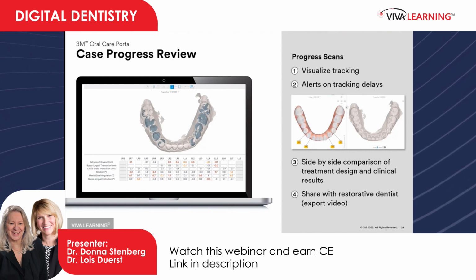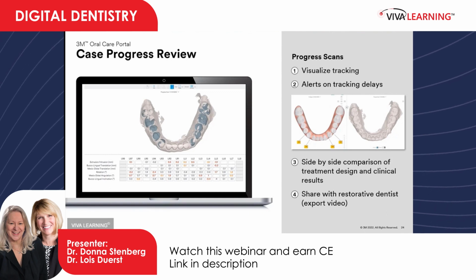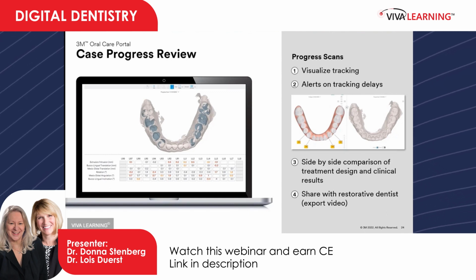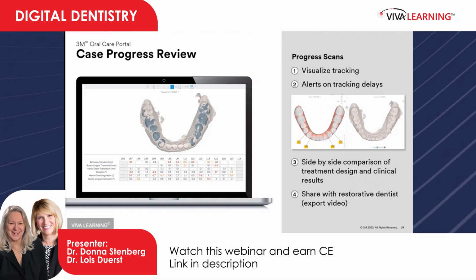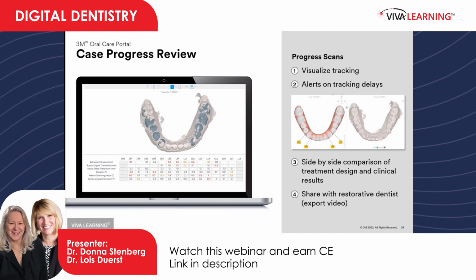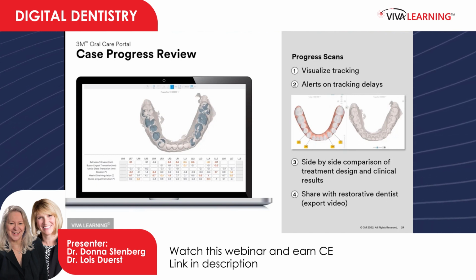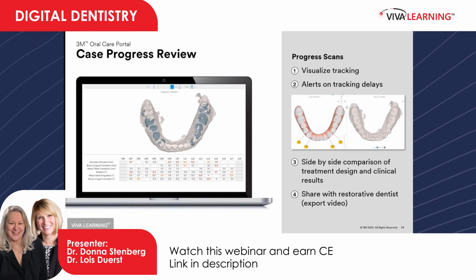You can use the movements table again to quickly draw your eye to what's not tracking with the treatment design. Sometimes a side-to-side view can help you see the changes more clearly. And while I'm right there in the portal, I can export a video to Lois so she can see the progress to date. It reminds her that we have a case together and assures her that progress is being made.